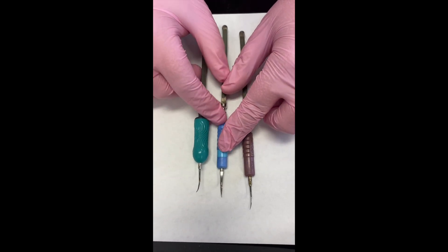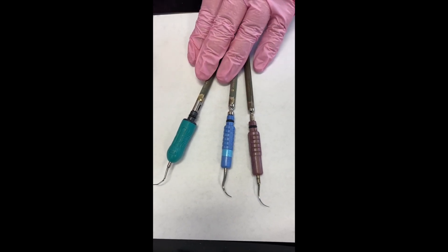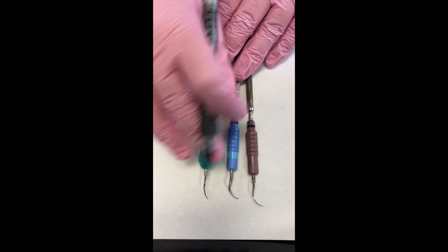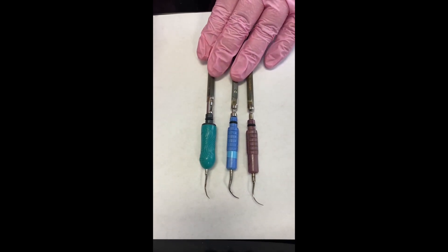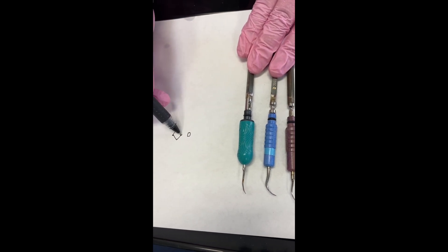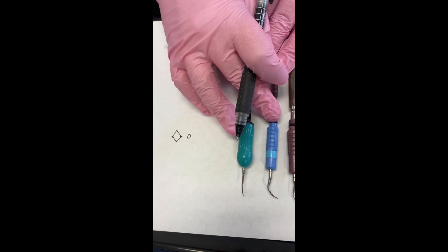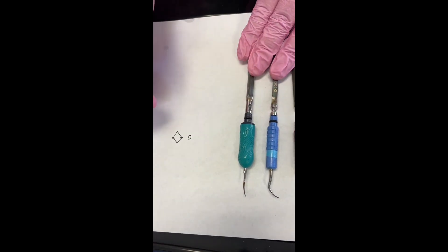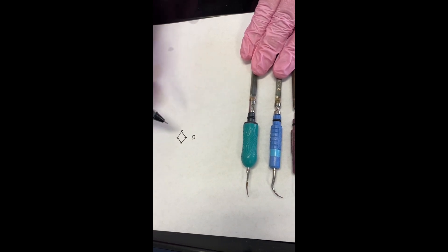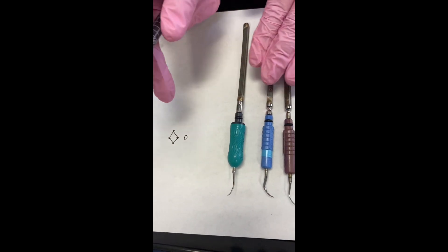This blue one has a diamond cross section, so you have round and diamond. The thing about the diamond ones is you have a little edge to it — it's not sharp like an instrument, but you do have a point where the power sits, and it can get a lot of bulkier, heavier calculus off. The tricky thing is it does have a lot of power in those little diamond points and can make the tooth pretty sensitive.